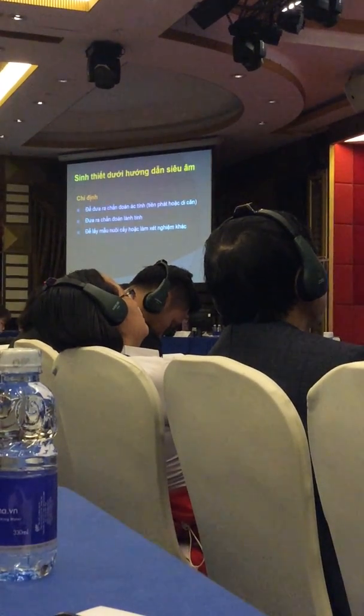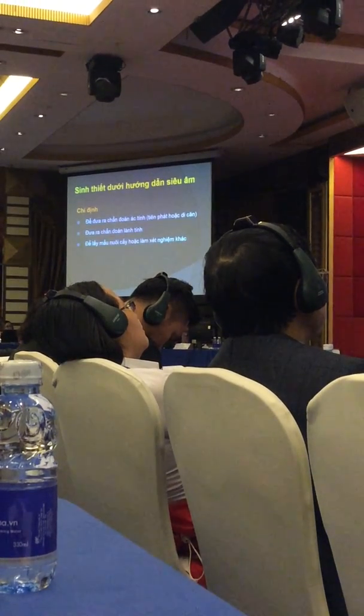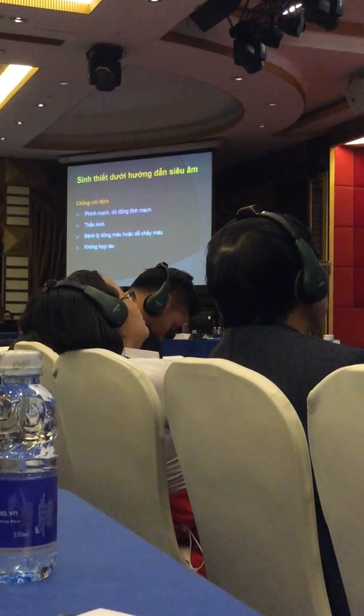You also can do ultrasound guided biopsy to obtain material for culture or other lab studies. Some contraindications.